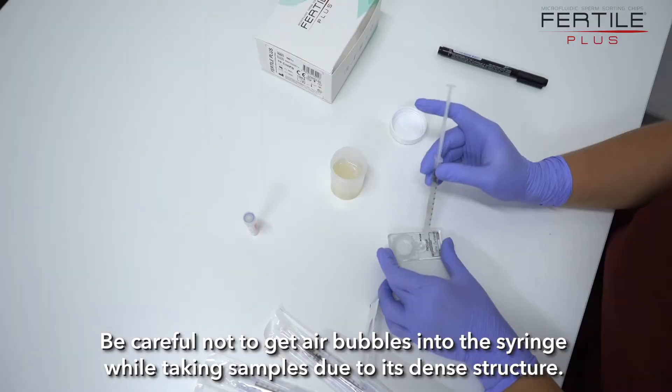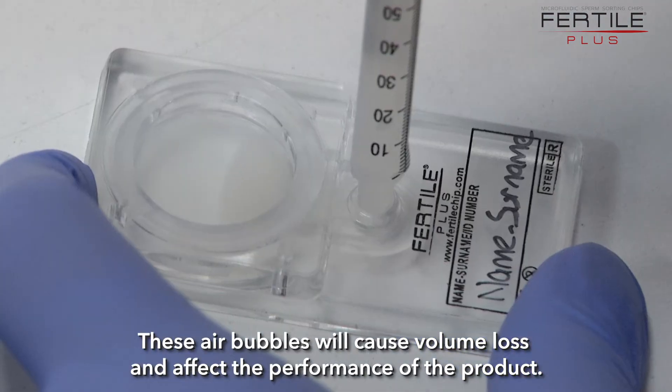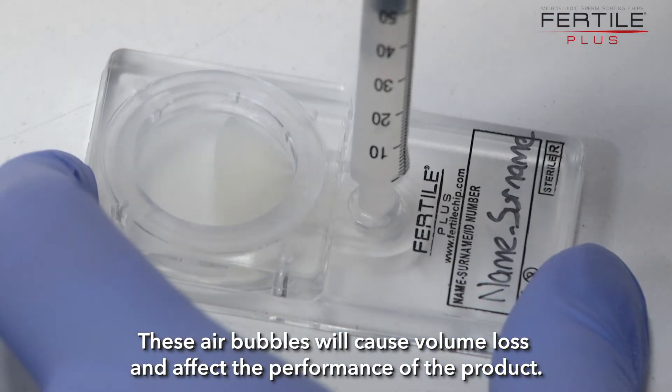Be careful not to get air bubbles into the syringe while taking samples, due to its dense structure. These air bubbles will cause volume loss and affect the performance of the product.